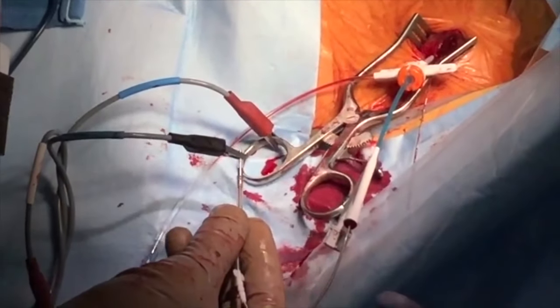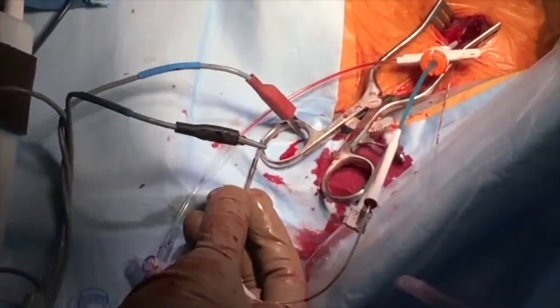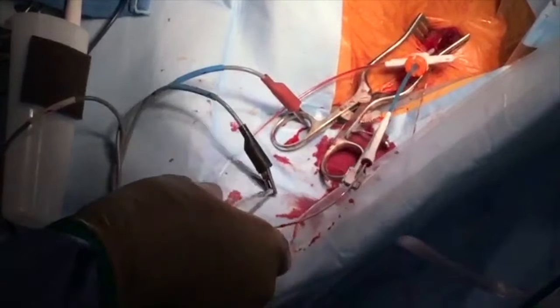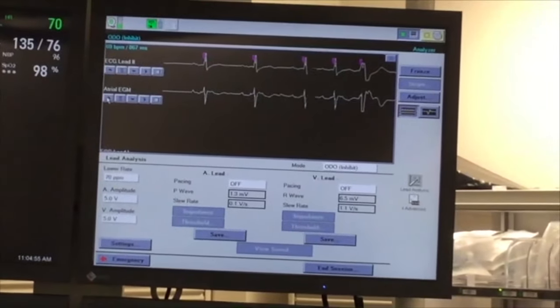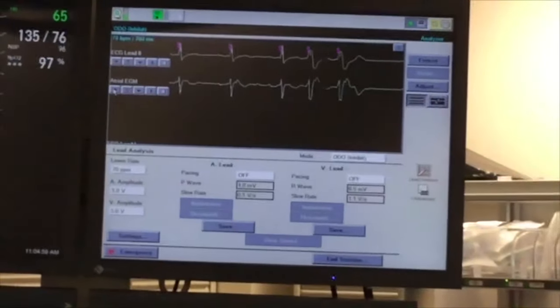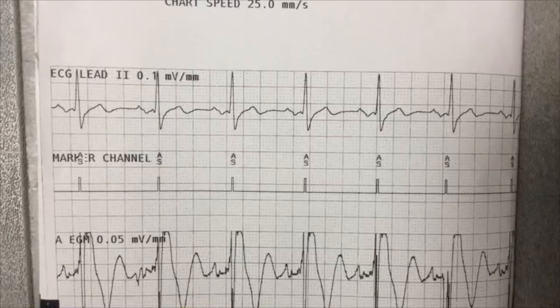Sometimes a printout on the PSA can clearly show his deflections. In this case, there is a small atrial deflection followed by a his deflection, which is followed by a local ventricular electrogram. If clear his deflections are not seen, pace mapping can be performed to ascertain the exact location of the lead tip. Pacing is then performed without the lead being screwed in. We like to start pacing at an output of 5 volts at 1 millisecond and gradually drop voltage to see responses to various pacing outputs.